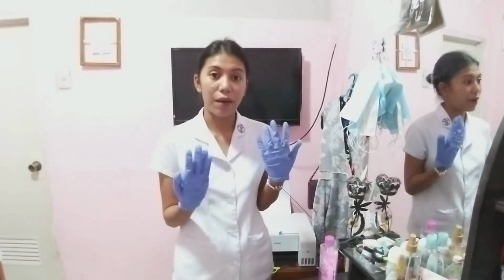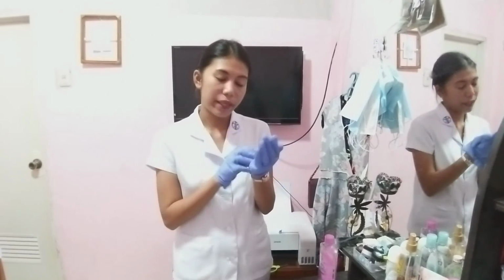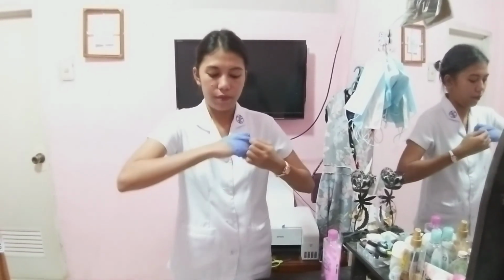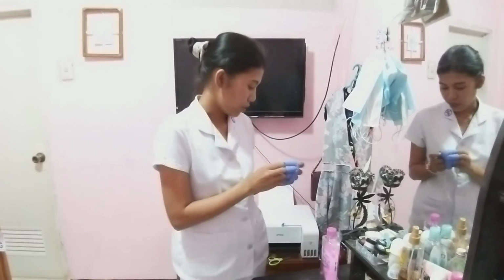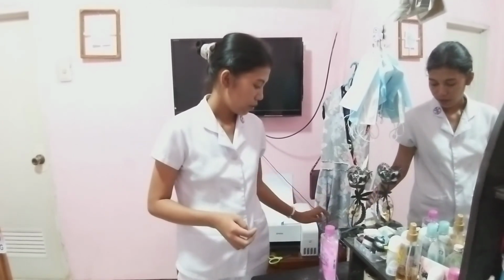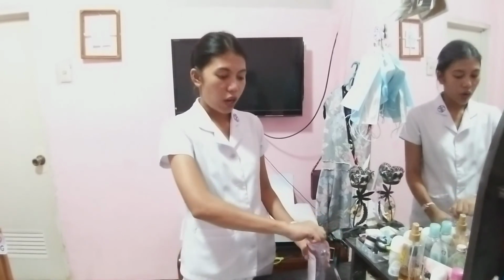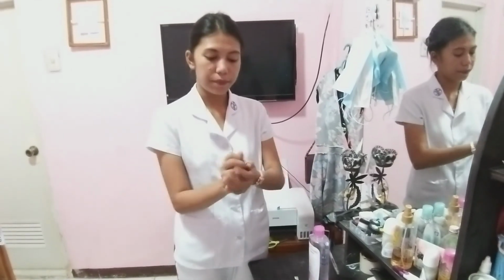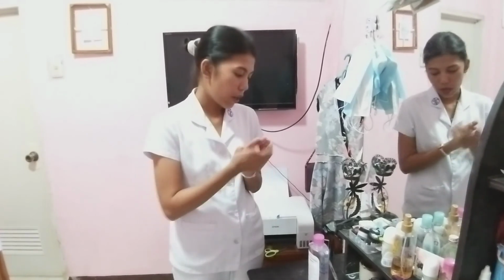So first, I am going to remove my gloves and dispose of them properly. And now I am going to put some ethyl alcohol to disinfect my hands and observe other appropriate infection prevention procedures.